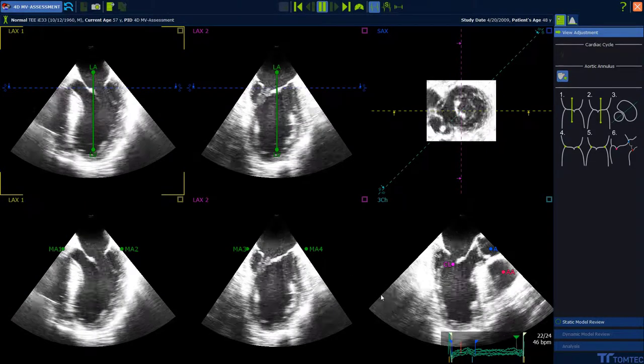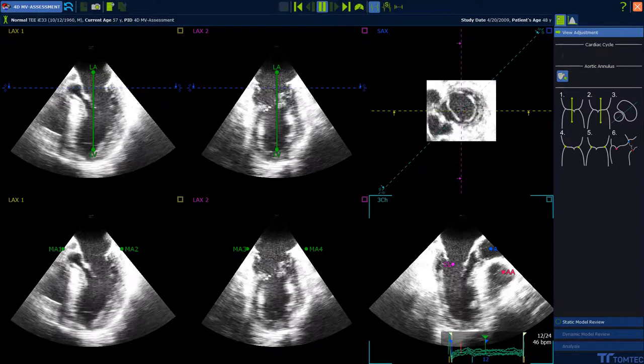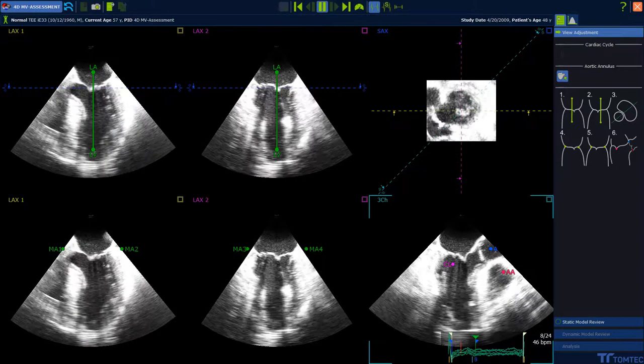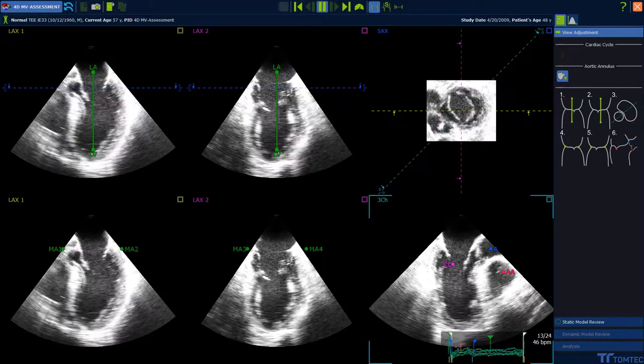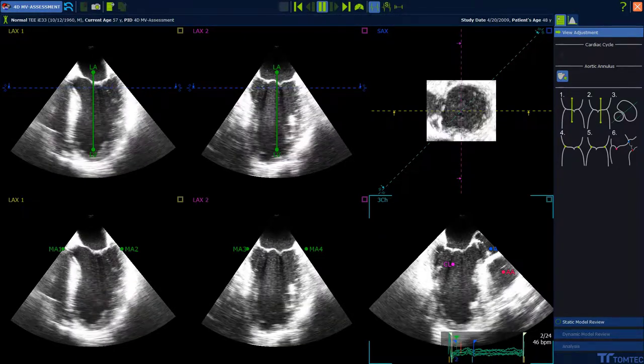If necessary, drag and drop the blue flags to correct the position of end-diastolic and end-systolic. The mitral valve is closed in between.